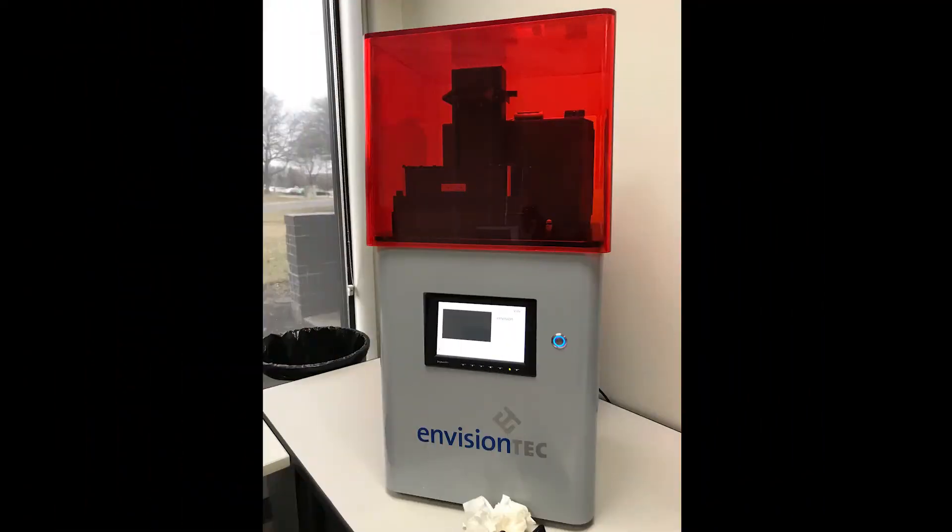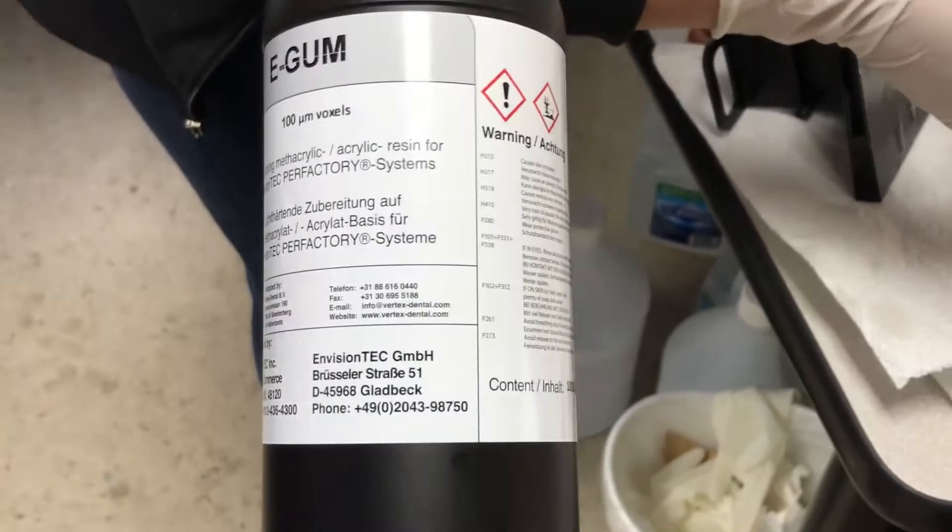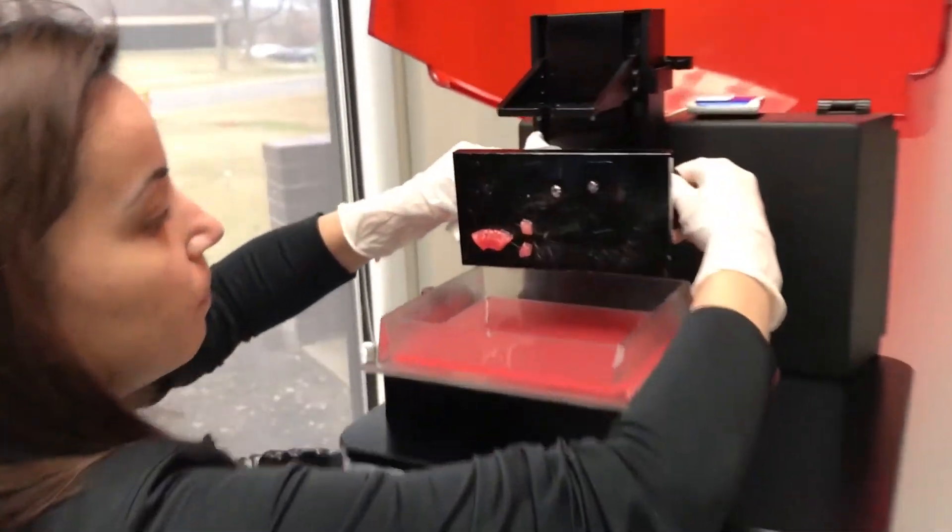Next we used an EnvisionTech 3D printer with e-gum light curing methacrylic acrylic resin and printed the file.